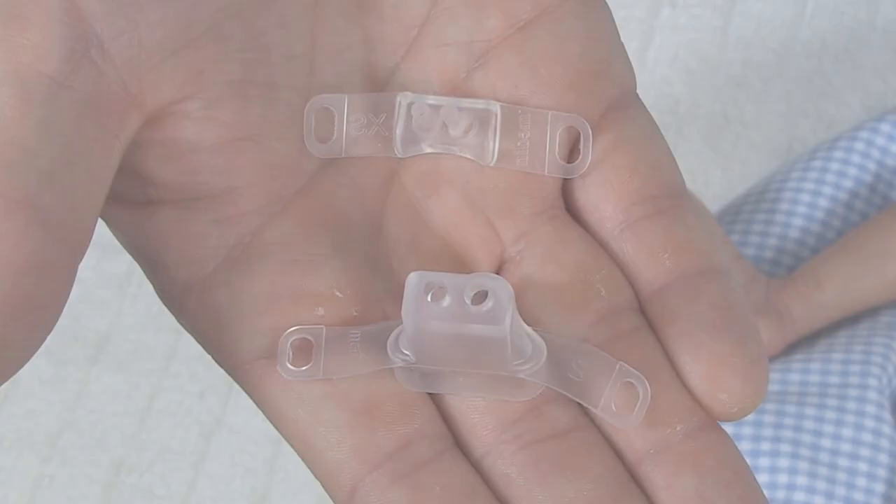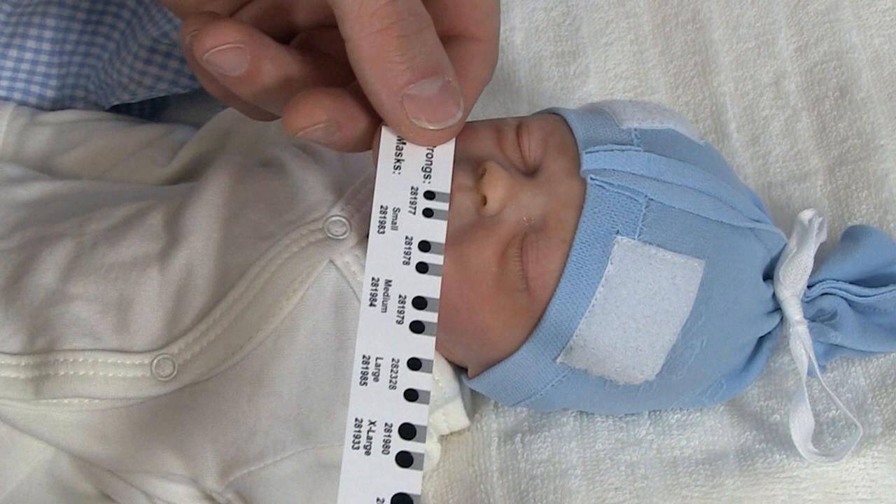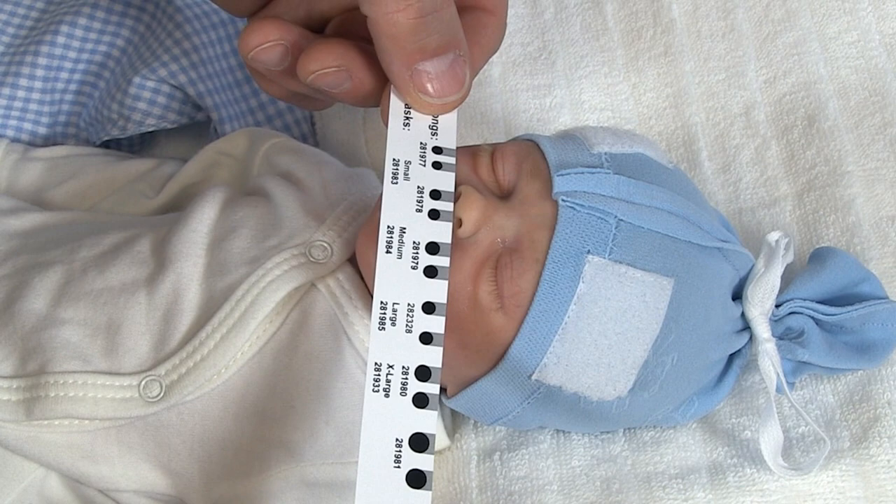You can use either a mask or prongs. In case you are using prongs, there are graphics on the side of the measurement tape to help you find the right size. Just hold the tape under the baby's nose to measure the size and width of the nostrils.